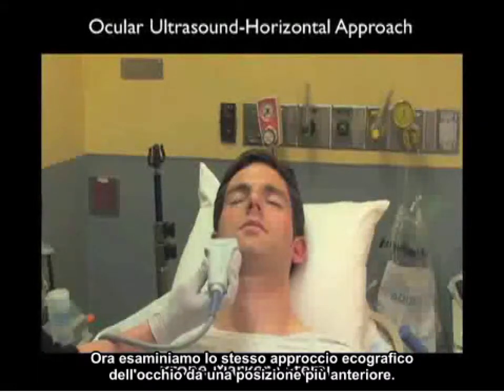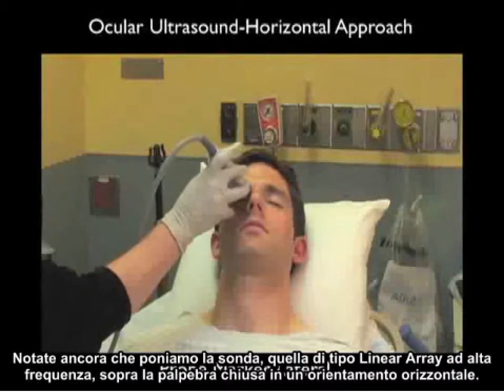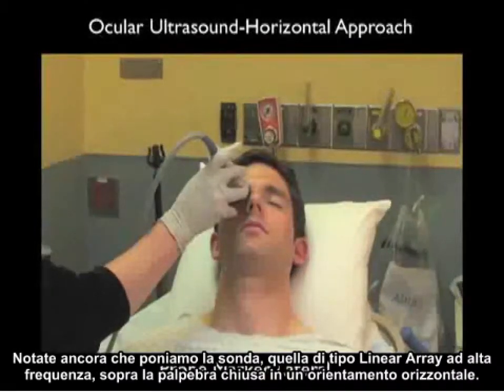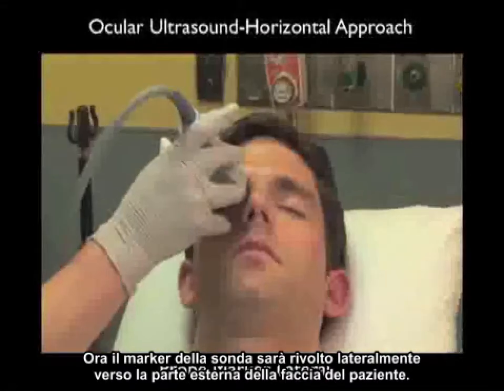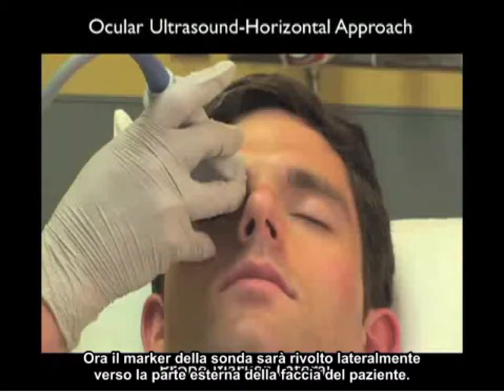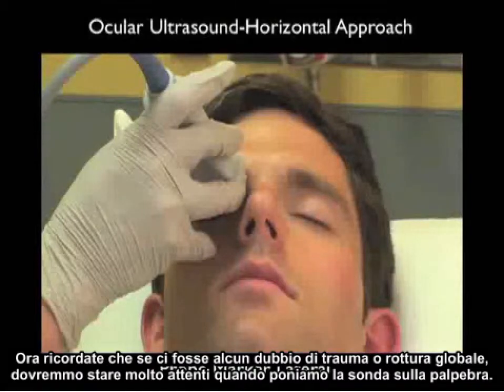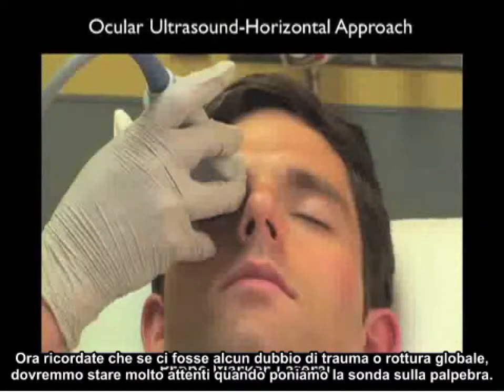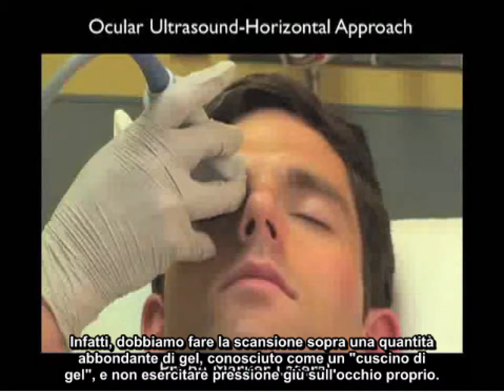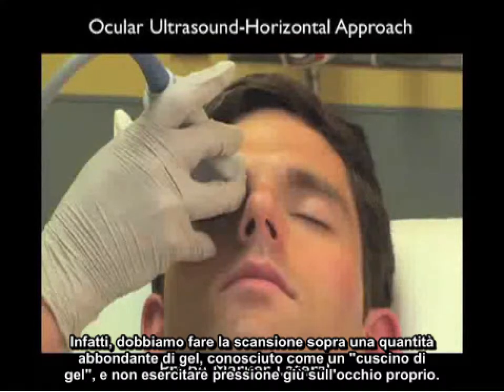Now let's take a look at that same ocular ultrasound approach from a more anterior position. Note again that we're placing the high-frequency linear array probe over the closed eyelid in a side-to-side orientation, with the probe marker oriented laterally towards the outer part of the patient's face. Remember that if there's any question of trauma or globe rupture, we have to be extremely careful when applying the probe onto the eyelid. In fact, we should be scanning through a copious amount of gel, known as a gel pillow, and really not applying any pressure down to the actual eye.